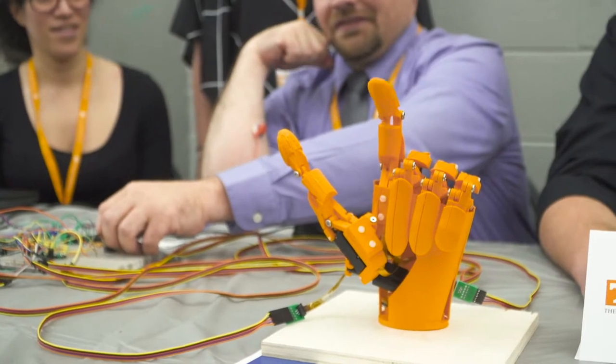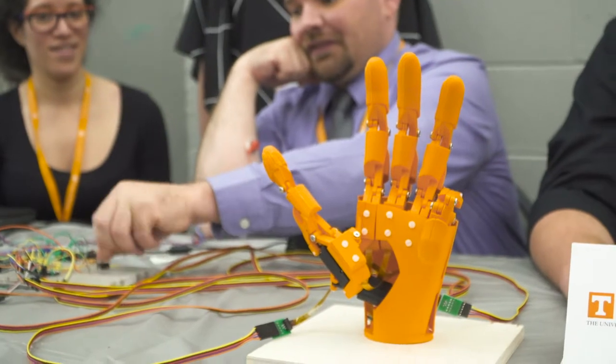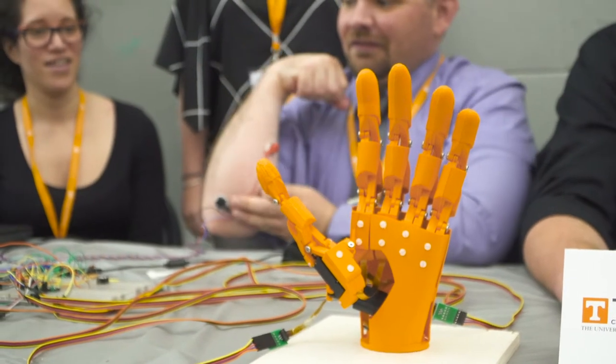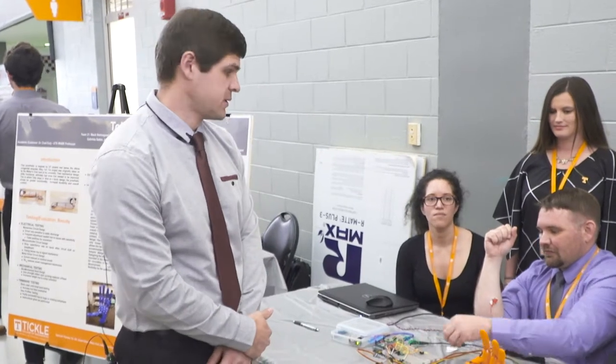Our team focused on developing the hand portion of the prosthetic. As you can see here, it is designed to operate off of a simple sensor that will be integrated into the forearm portion of the prosthetic arm and operated by simply flexing her muscles. She has been tested with the MyoSensor and it does function with her arm.